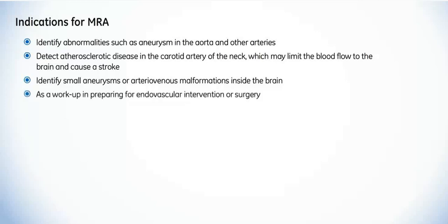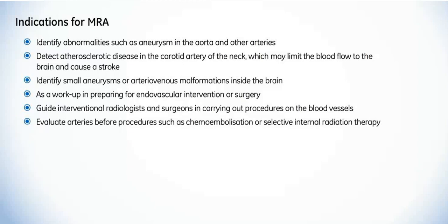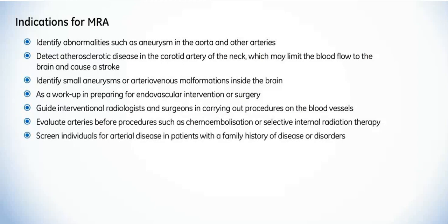It may also be beneficial in preparing for endovascular intervention or surgery. MRA is a useful tool to guide interventional radiologists and surgeons carrying out procedures on blood vessels. MRA facilitates the evaluation of arteries before procedures such as chemoembolization and selective internal radiation therapy. It is invaluable in screening individuals with a family history of arterial disorders.